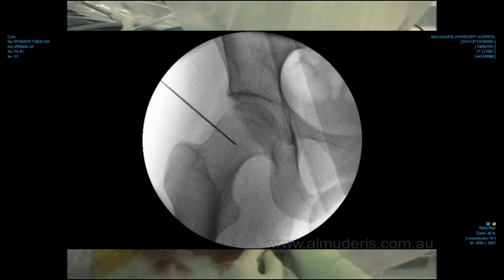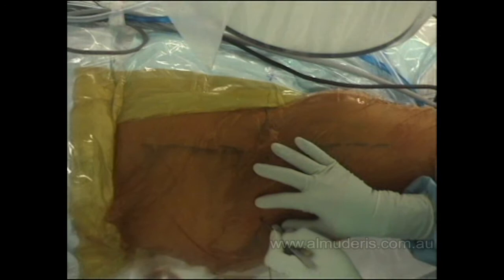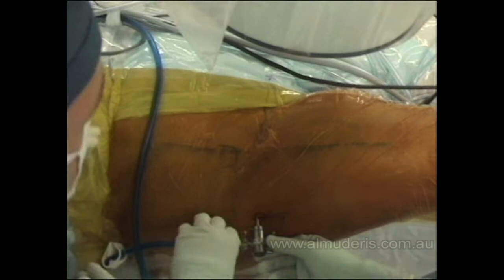Once I go through the capsule I use a guide wire. Using the trocar, I go through the capsule and then we attach the fluid.